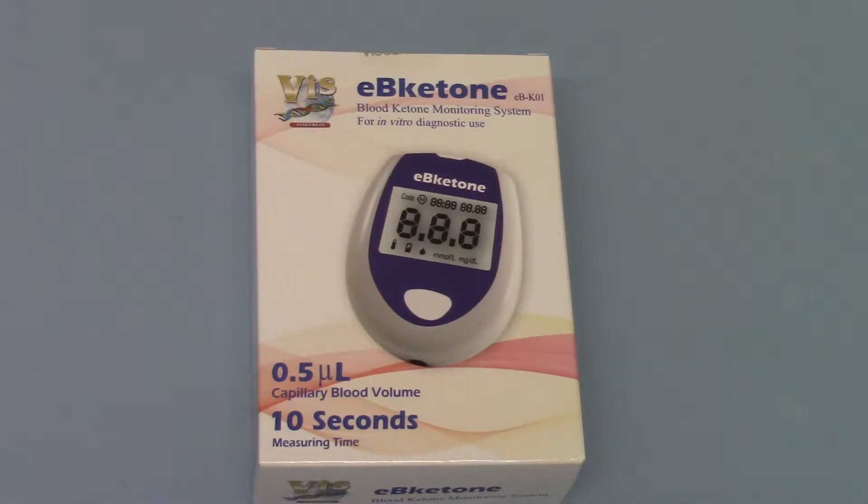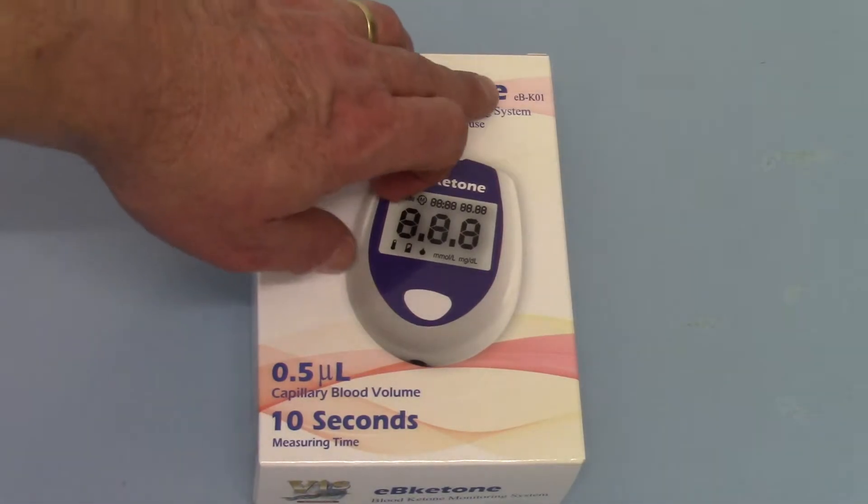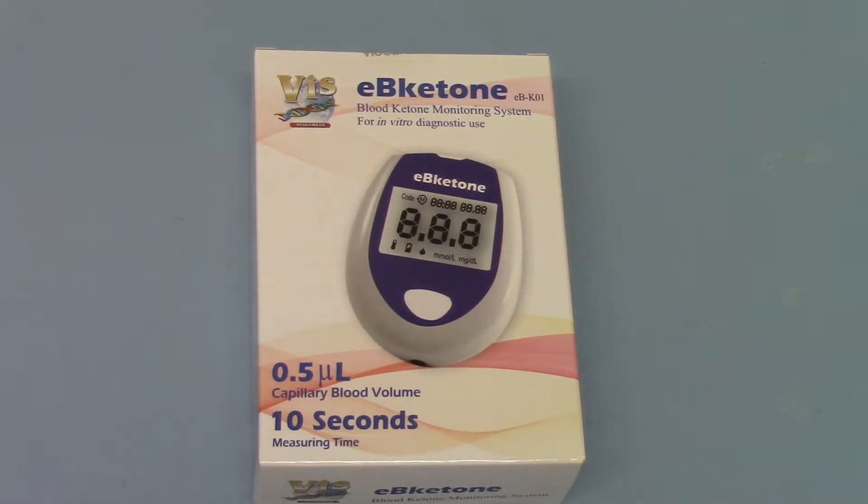The EB ketone meter is one of the latest ketone meters to come onto the UK market. The catalogue reference number, or manufacturer's part number, is the EBK01.